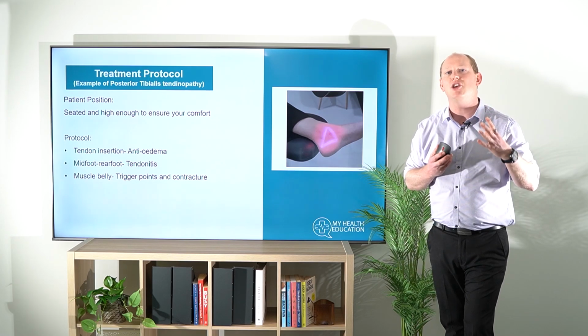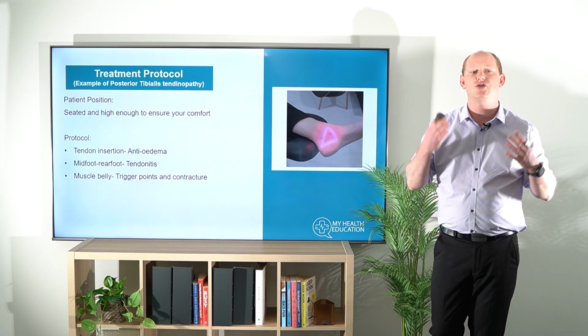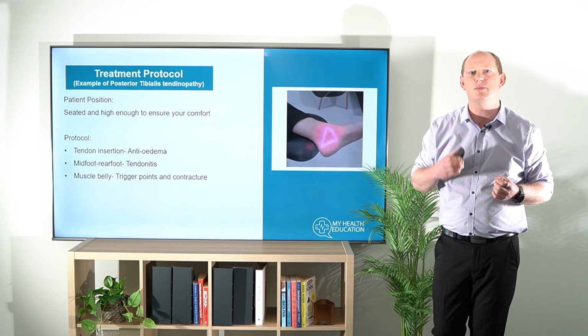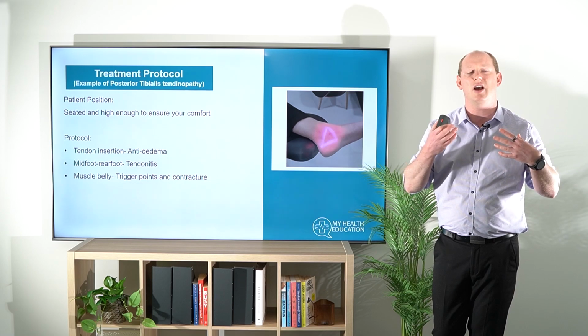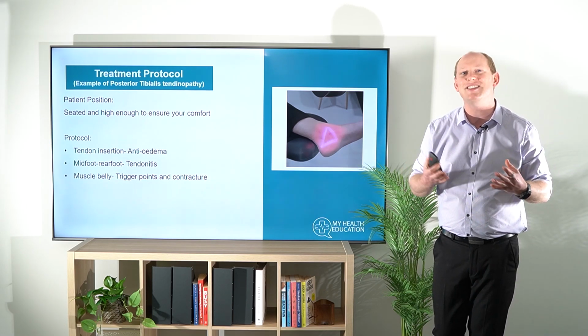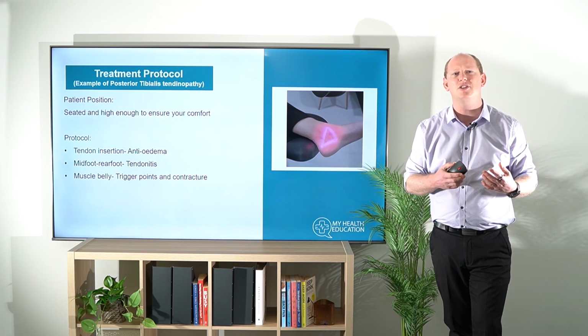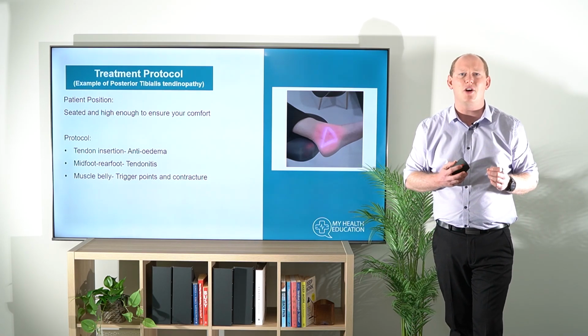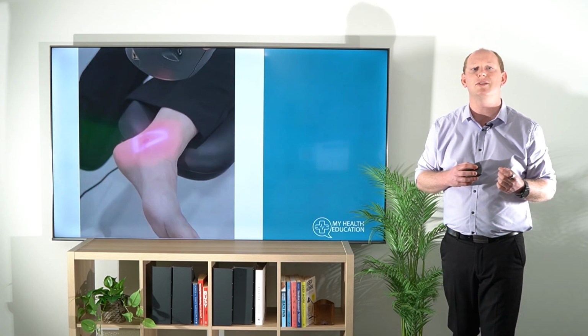But you do need to make sure that you're not neglecting the muscle belly. Obviously the tendon can't stretch, and so by releasing any of those trigger points and putting something on like a contracture setting to make sure that the muscle's more like jelly is how I explain it, nice and loose and free, and that fiber alignment is going to be a lot better, then that's where we're going to be much better off when we're looking post PBMT therapy.